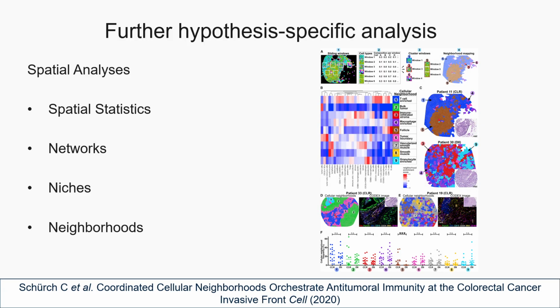And maybe perform and analyze our images using tools available in the literature, such as cellular neighborhoods. Now, these are dependent on the specific questions and hypotheses being asked about the images, whereas this workshop will get us to cell composition, the objects which can then go further depending on those questions.